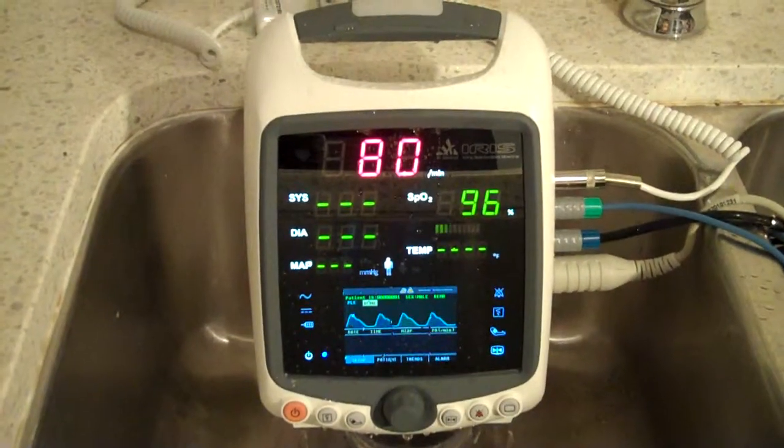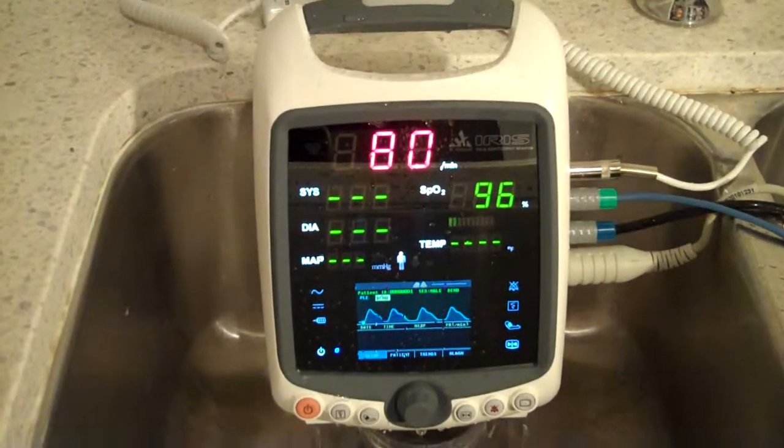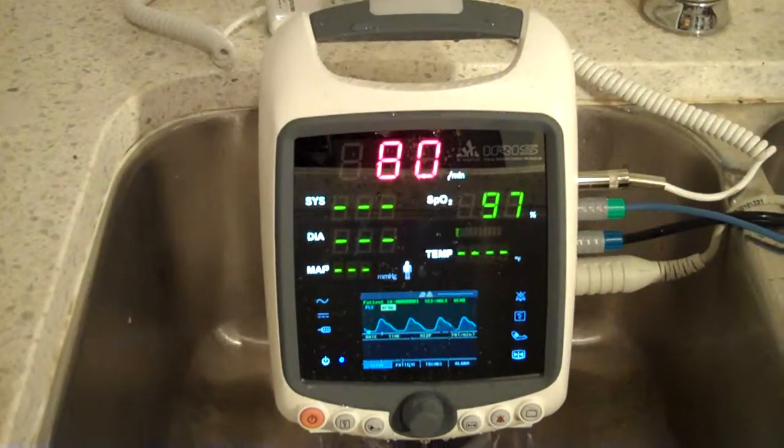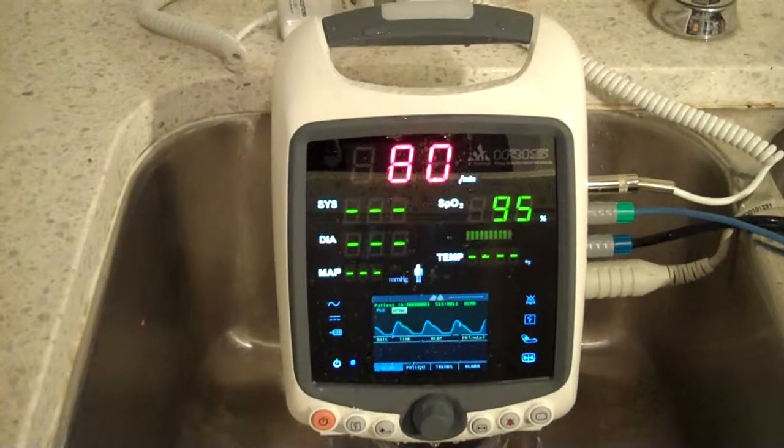Hi everyone, this is the Biomed Equipment Patient Monitoring System 83. As you can see, we're going to do a demonstration on how this patient monitor can resist water.